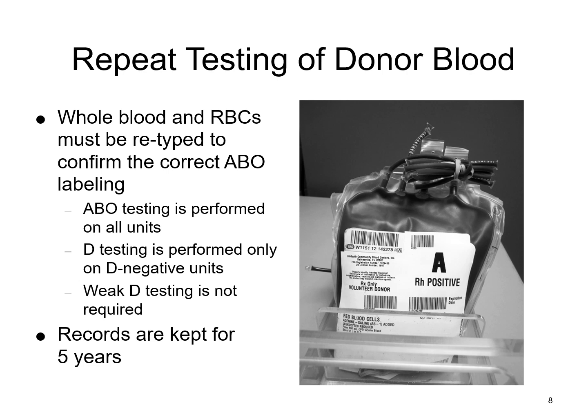If it's an O unit, you may use anti-A,B, but most places are just going to do your A and B anyway. It's easier to go ahead and set up all your testing for the A and B, regardless if it's an O. And then for the anti-D, you're going to make sure that it's D. You're going to do an anti-D tube as well, or whatever your method is for checking it.